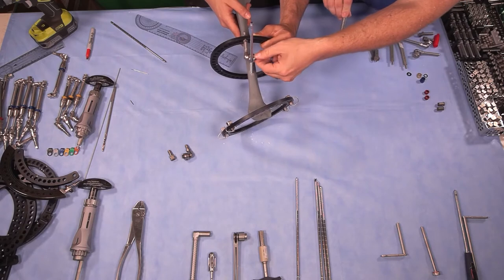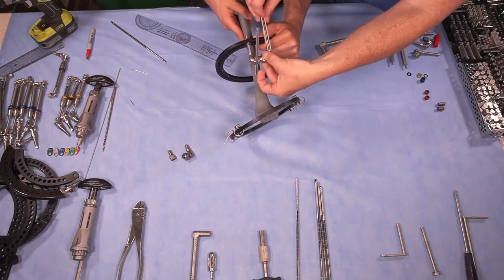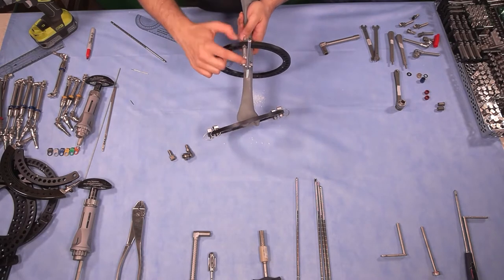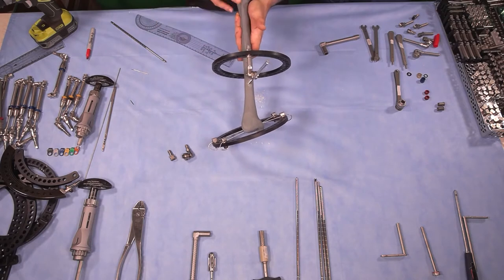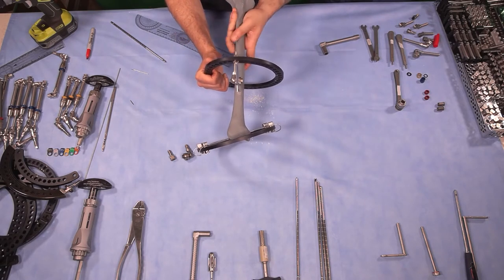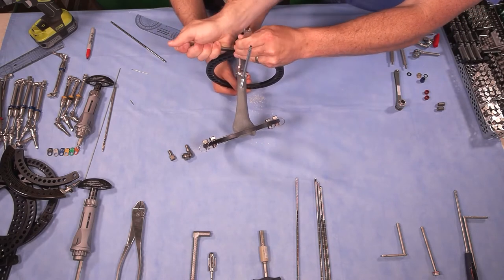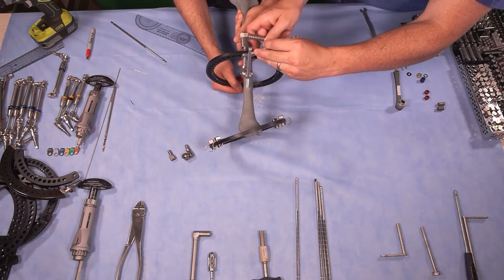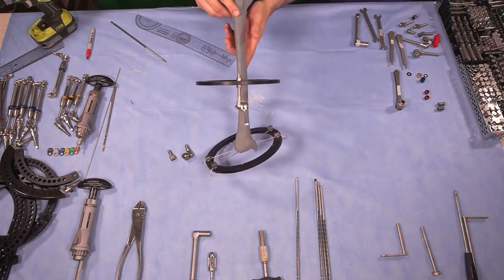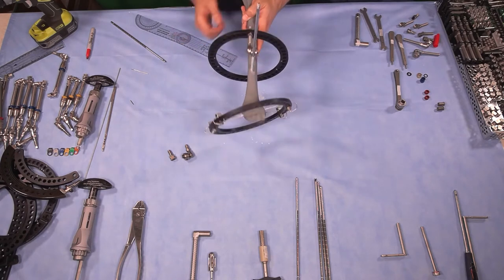On fluoroscopy you can verify that your ring is orthogonal — if the threaded rod is collinear with the tibia, that works. Here we can see that our ring is not very well centered, but because I only have one pin and everything is still mobile, I can loosen the nut, re-adjust it, and re-tighten it. There is still a certain level of play, but you can see that this ring is pretty well orthogonal to the tibia. The system doesn't require rings to be completely orthogonal, but we try to do it anyway.